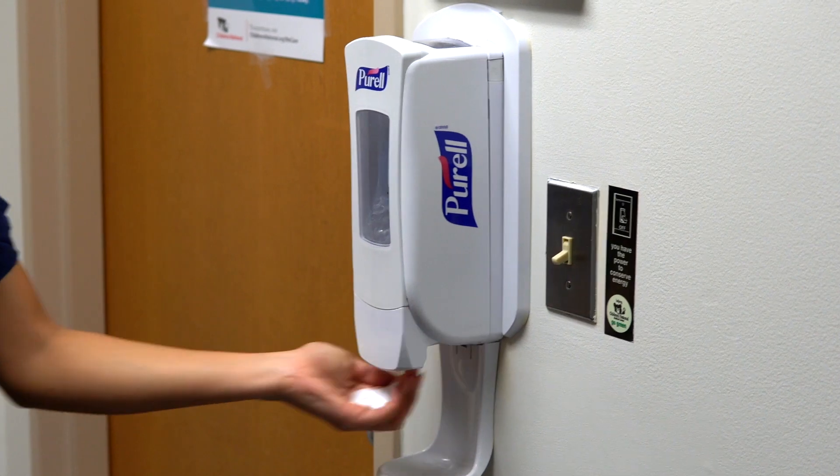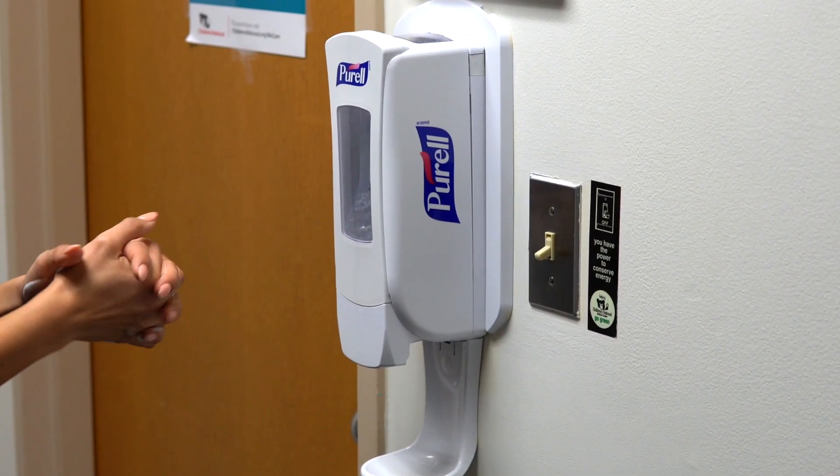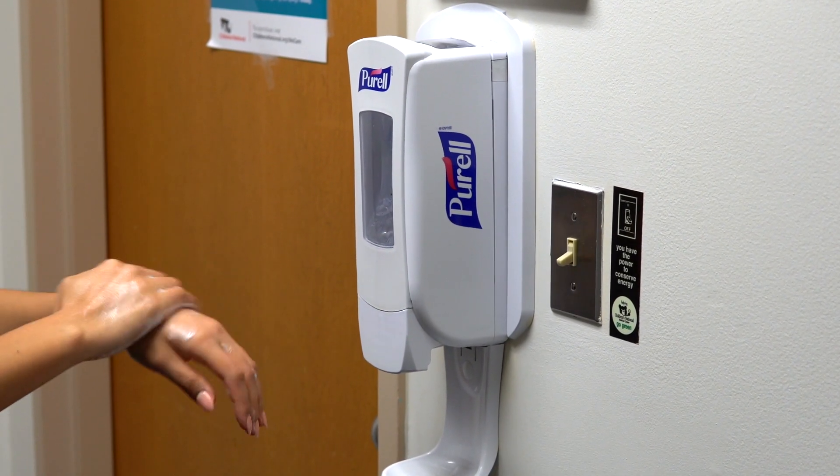Perform hand hygiene. Sanitize or wash all areas of hands: palms, fingertips, back of hands, between fingers and thumbs.